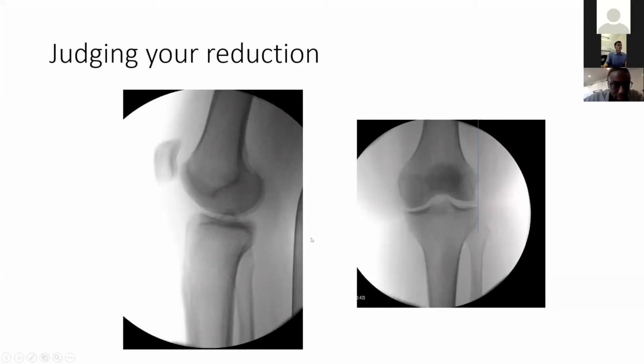I think the overlap is slightly too much, as well as the joint surfaces aren't fully aligned. Yeah. And so you'll probably do a little wag to align your joint surfaces better, and maybe a little extra rotation as well. I would argue just rotation.